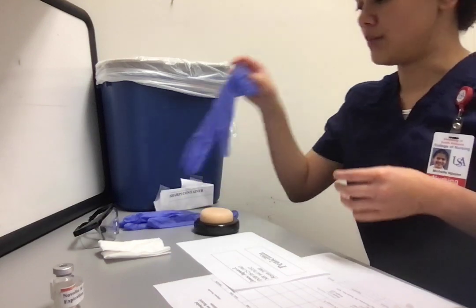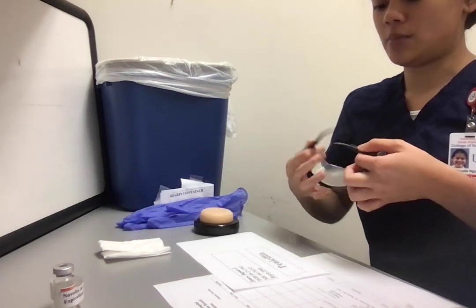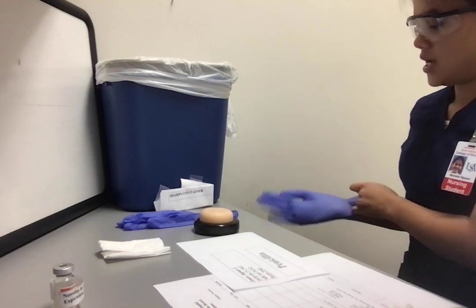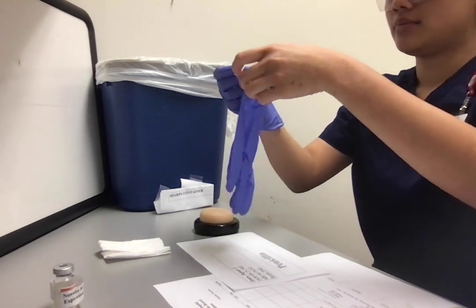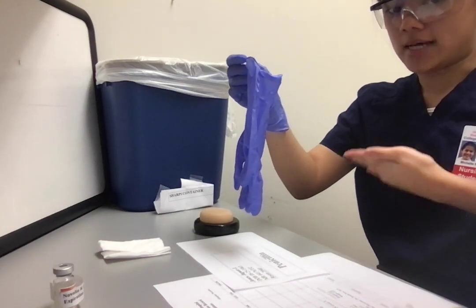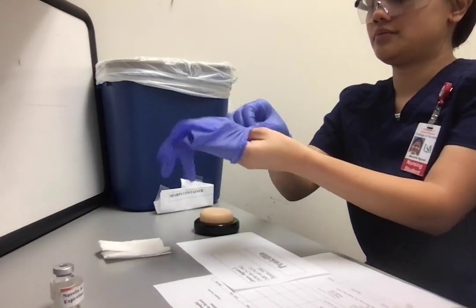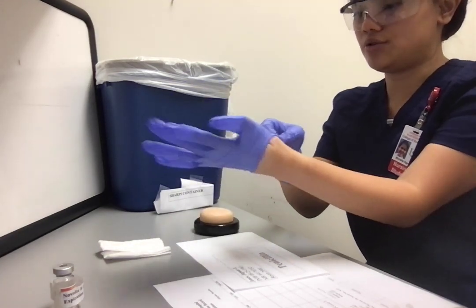So now I'm going to tell my patient that I am going to be giving them an insulin injection, which, since it's subcutaneous, is in the abdomen. So if we go 2 inches around, we can't go past the costal margin, not below the pubic area, and not past the anterior superior iliac spine. And I can go at a 45 or 90 degree angle.